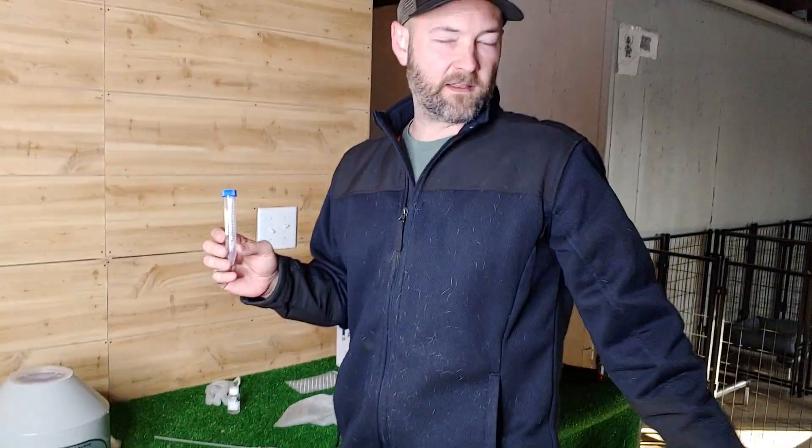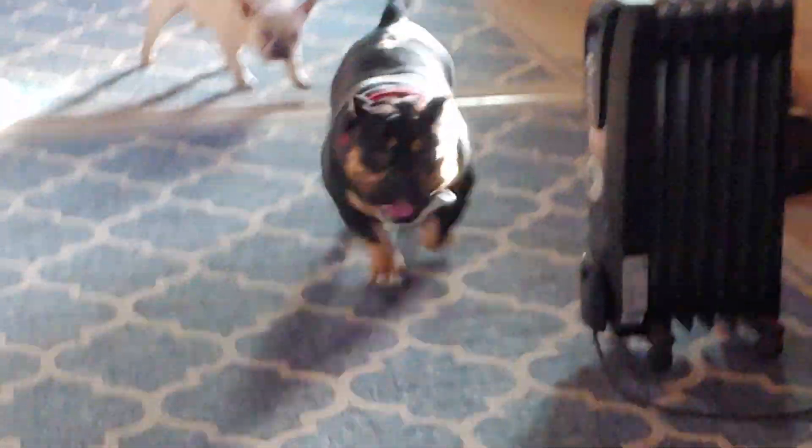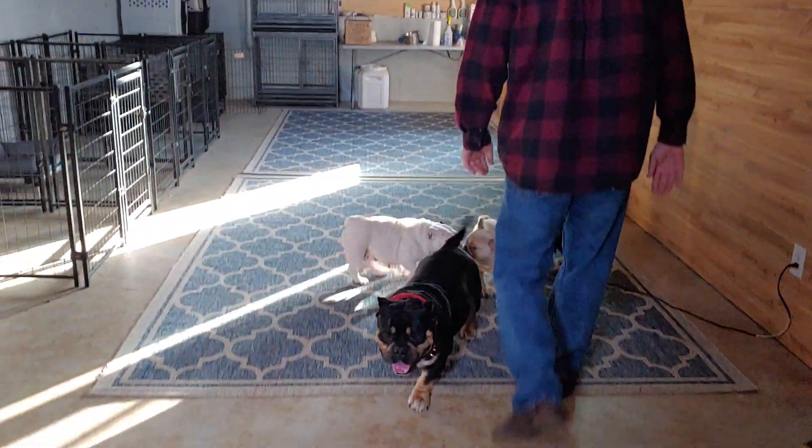This collection is from Legend — he's going out to Texas. He just had eight puppies out in California using this process.